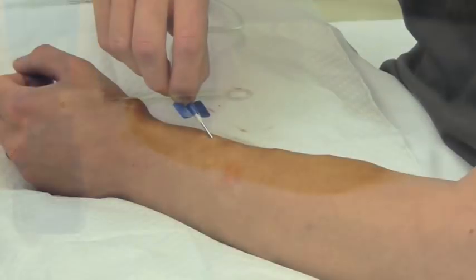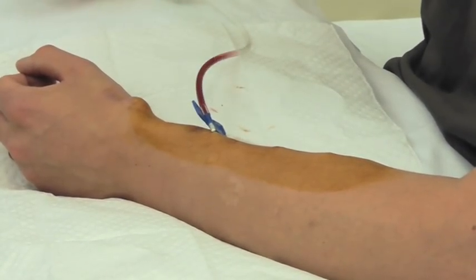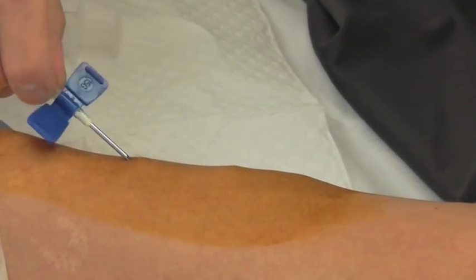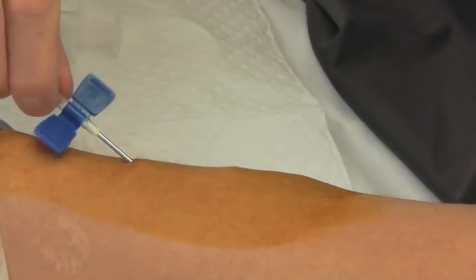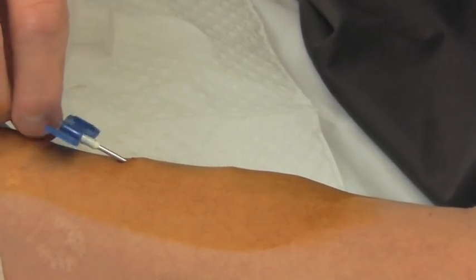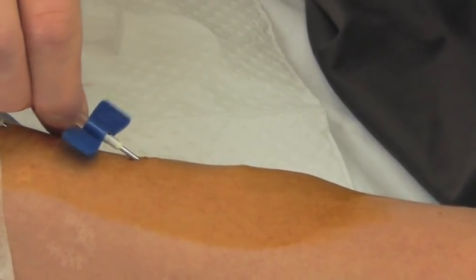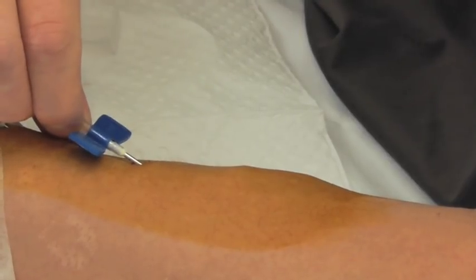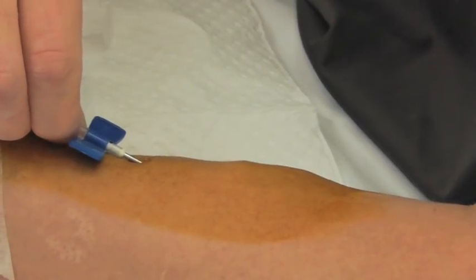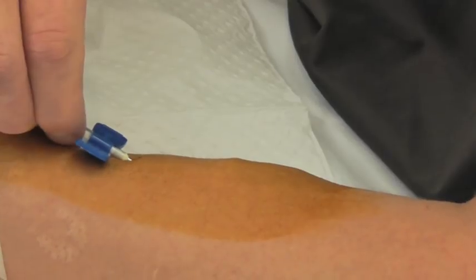Once you feel that the tract has formed well enough and the needles are going in well you can swap to blunt needles. When needling with a blunt needle you should hold the needle by the tubing and not by the wings and should twiddle the needle into the tract. You will notice when this man can't first find the tract he pulls the needle back until he finds the tract. As the tract gets better he will find that the needles go much more easily into the tract.